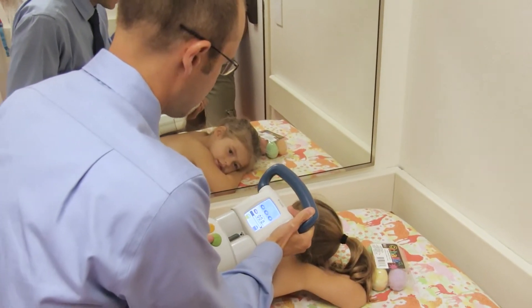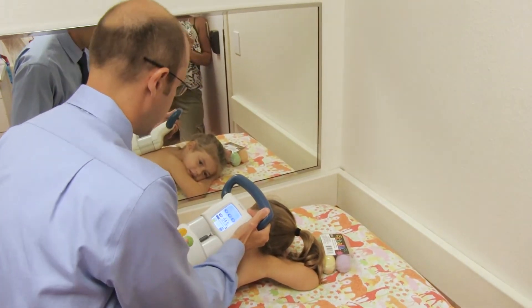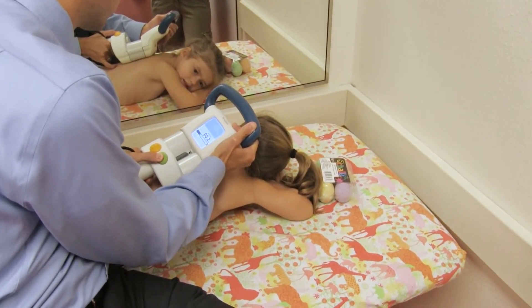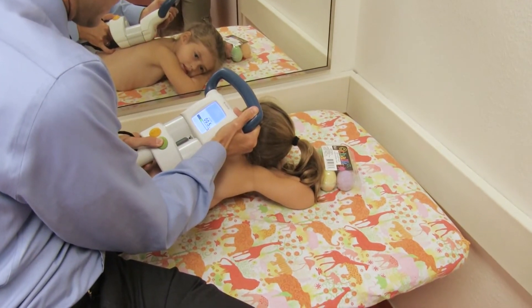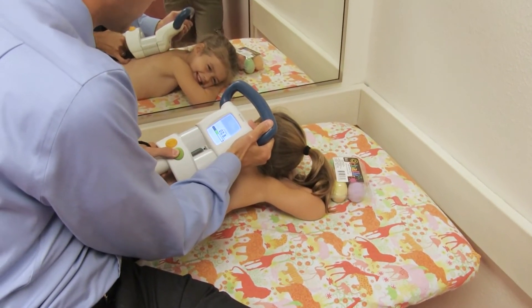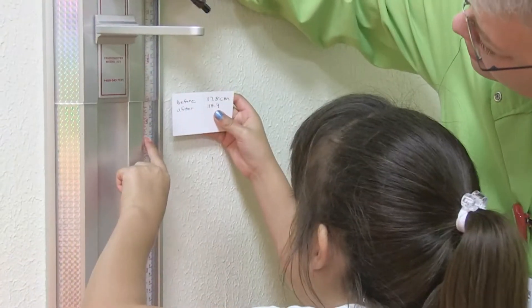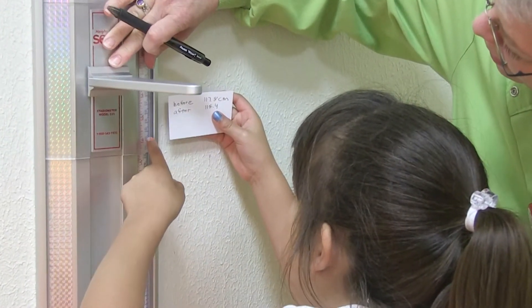Are you ready? It's going to find your magnet again. And when we press this button, it is going to make you taller. Do you feel taller? And then they just kind of stay on that cycle, coming back every few months to get lengthened a little bit at a time to kind of recreate as much as we can normal spine growth.